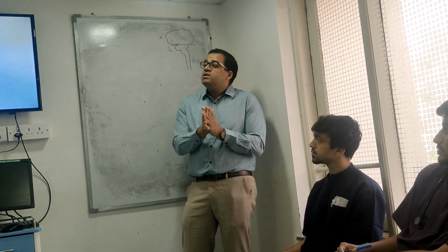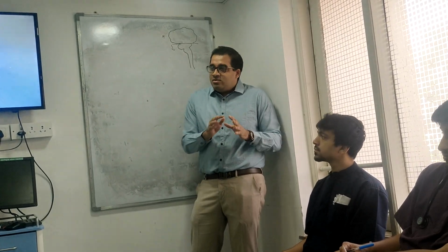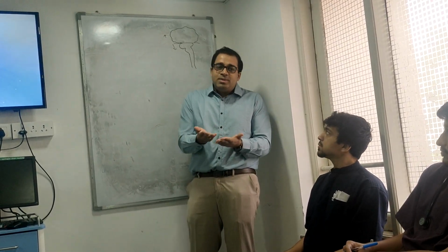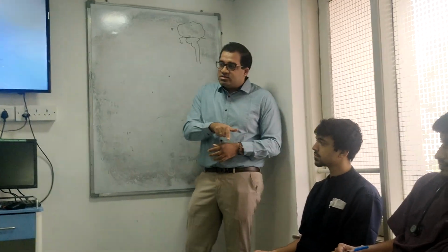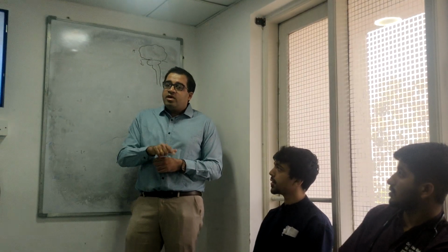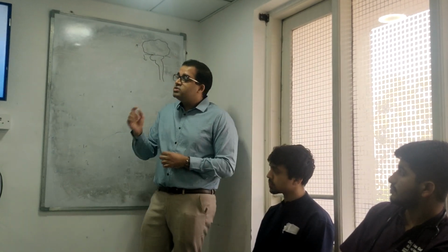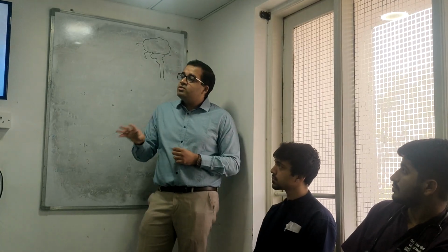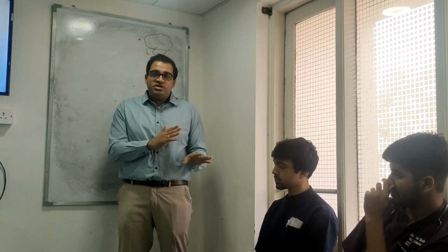ये 24-hour facility available होता है. Technician बताते भी हैं. तुम पूछते नहीं हो करके वो नहीं बताते. Their job is just to say GPC or GNB and finish it. You ask them, is it in clusters or is it in chains? Clusters is staph. Chains is strep or enterococcus. Short chains is enterococcus. Long chains is streptococcus. But chains बोल दिया तो पूरा diagnosis changes और clusters बोल दिया तो diagnosis changes.